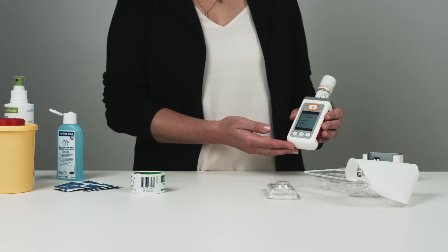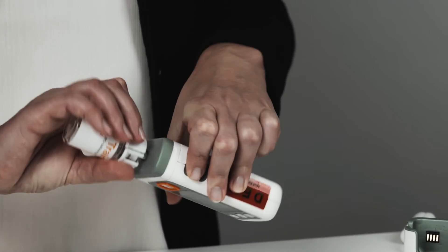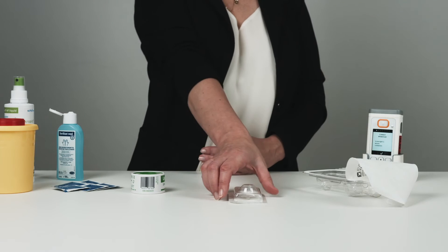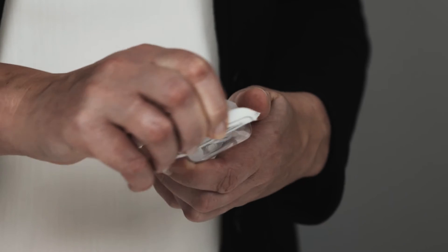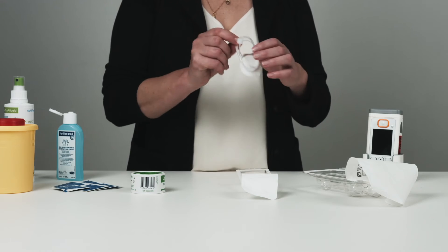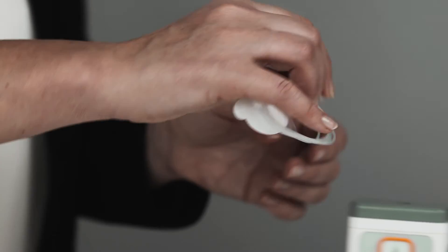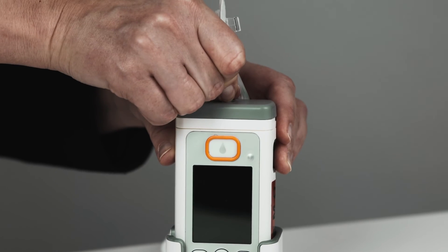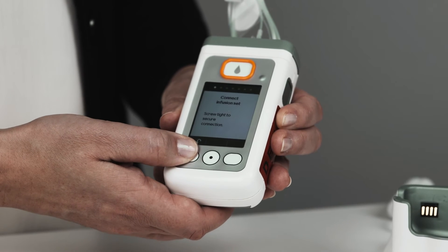Remove the pump from the docking station, turn it horizontally, and twist off the adapter and empty vial together. Now take the new unused infusion set, open the packaging, remove the cap, and screw the tubing tightly onto the reservoir. Click the checkmark button to confirm this step.